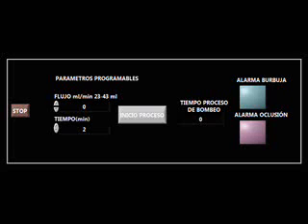For the activation of our infusion pump, we define two programmable parameters for the user and a control of the beginning of the process. One of the programmable parameters is the time for the infusion and the second one is the volume. In our case, our volume range is from 23 to 43 milliliters per minute, and the control for the beginning of the process is a push button that allows the system to begin the process.